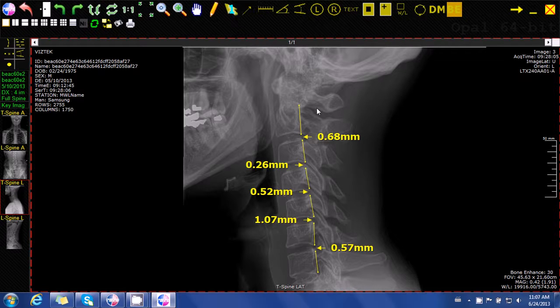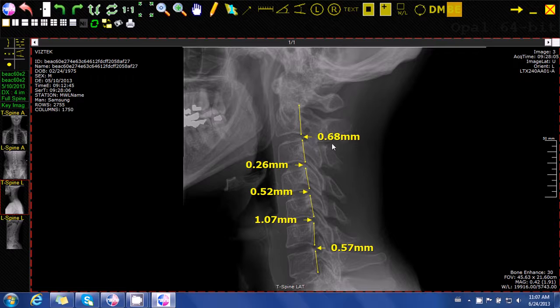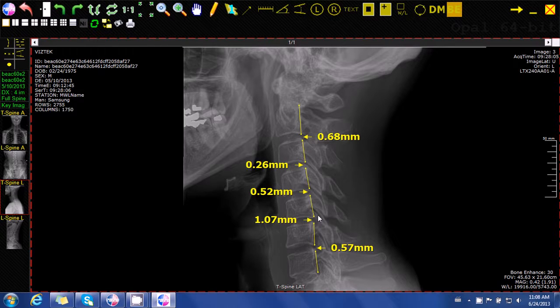For example, we can see that C2 is misaligned anteriorly in relation to C3 by 0.68 millimeters. Conversely, we can see that C5 is misaligned posteriorly in relation to C6 by 1.07 millimeters.